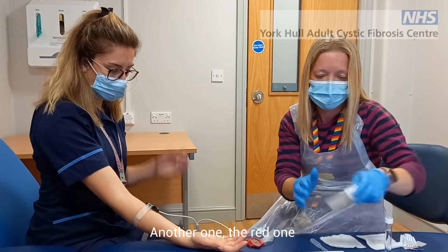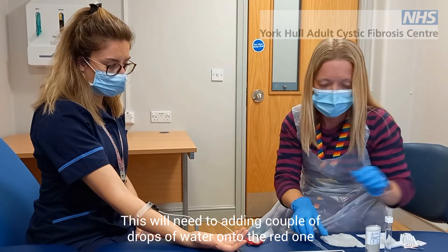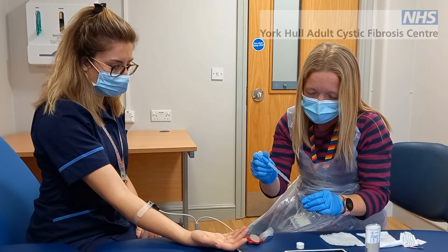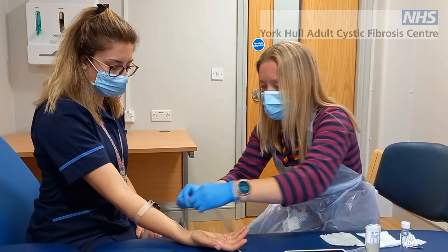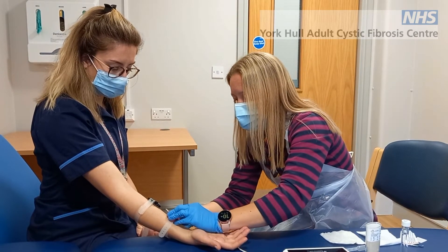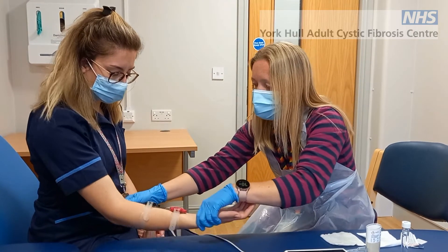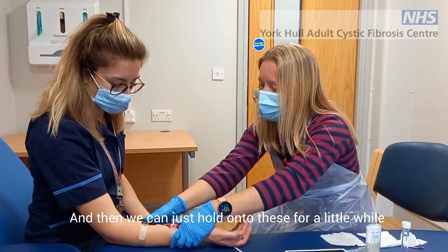With the other one, we'll put some in that one. We'll need to add a couple of drops of water onto it. So you'll want to rest your hand back — you'll be there for a little while now. Then we can just hold on to these for a little while.